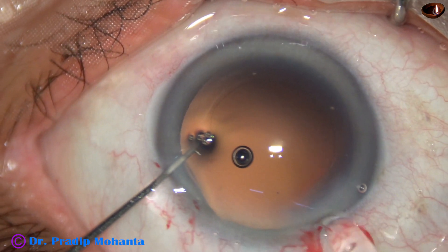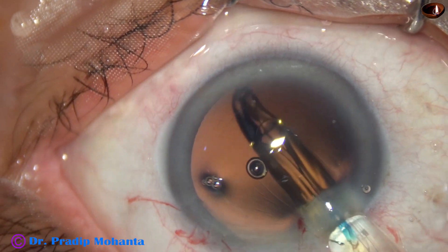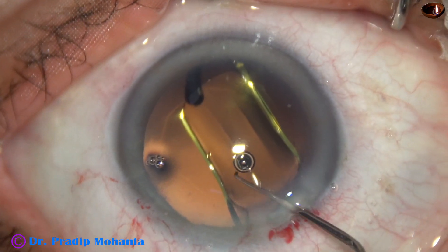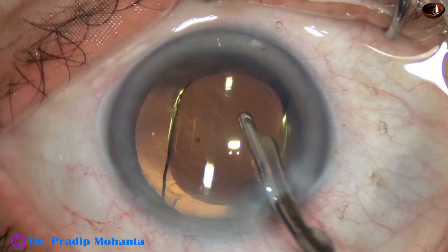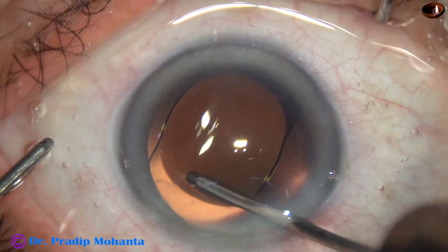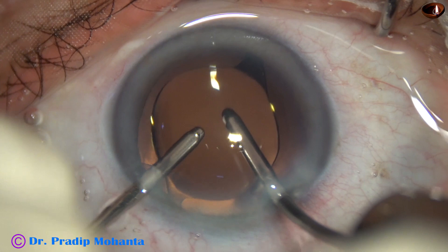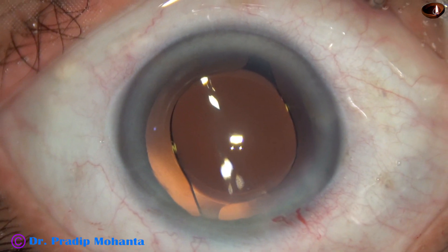We have to screw out the lens and that is why visco is necessary in such cases. The lens goes in, and now the visco used for implantation of this lens is to be removed. First I use the Simcoe cannula to remove some visco, and then I use the irrigation aspiration cannula for removal of the remaining visco. I go behind the lens and irrigate the capsular bag so that all the visco between the lens and the posterior capsule comes out.